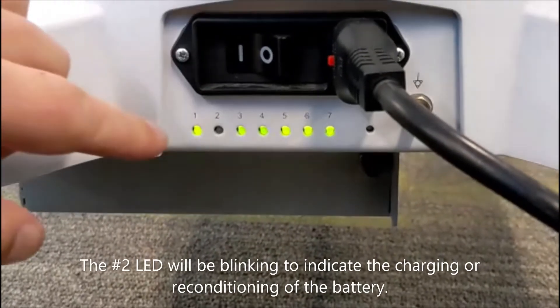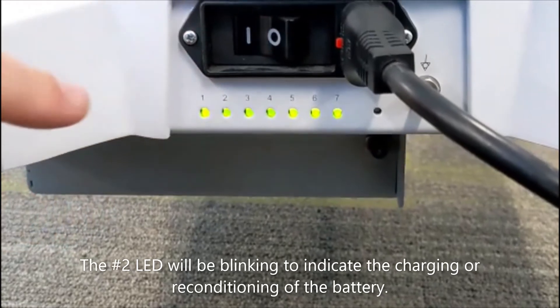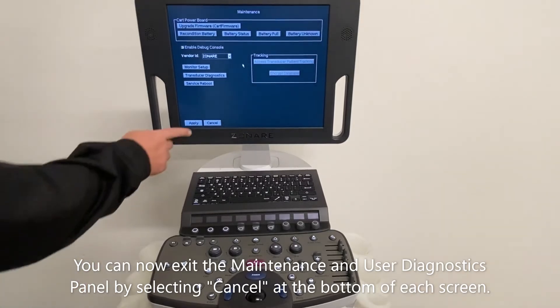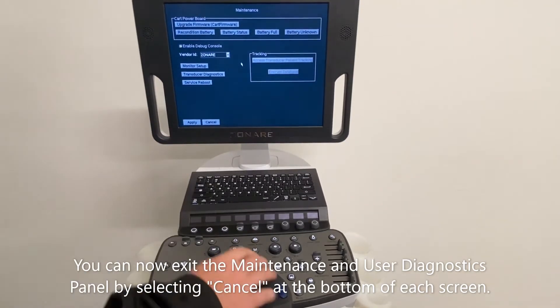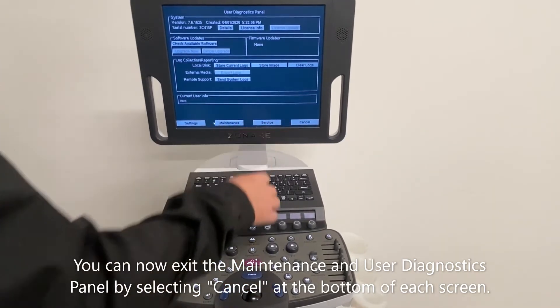The number 2 LED will be blinking to indicate the charging or reconditioning of the battery. You can now exit the maintenance and user diagnostic panels by selecting cancel at the bottom of each screen.